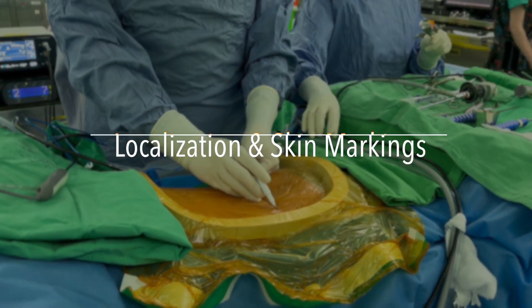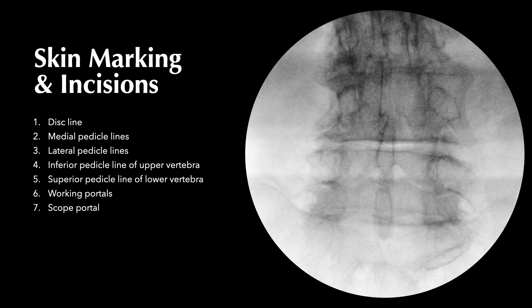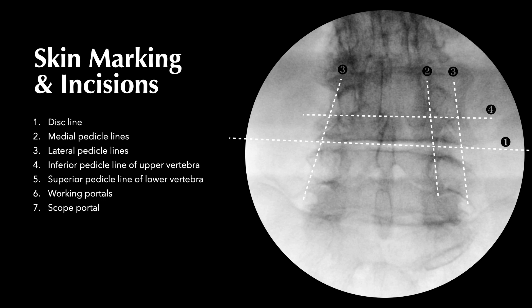First, we need skin markings for localization. We prefer the mini-open Wiltse approach between the multifidus and the longissimus muscles. The skin markings include the disc line, the medial and lateral pedicle lines, the inferior pedicle line of the upper vertebra, and the superior pedicle line of the lower vertebra.